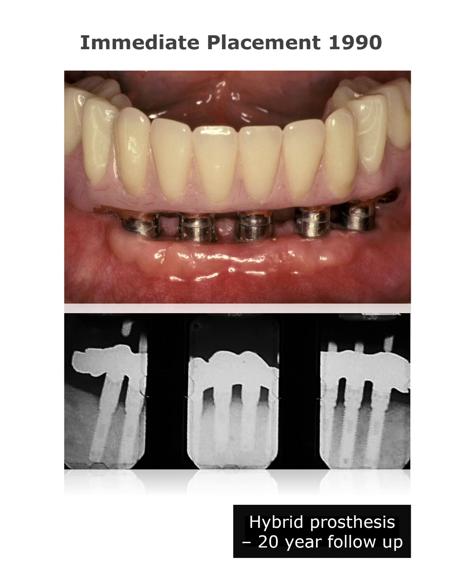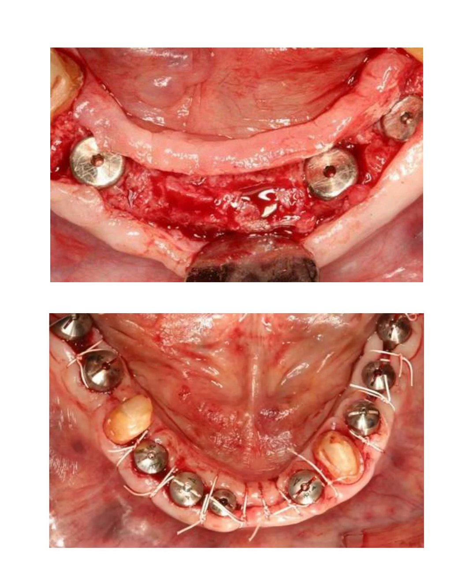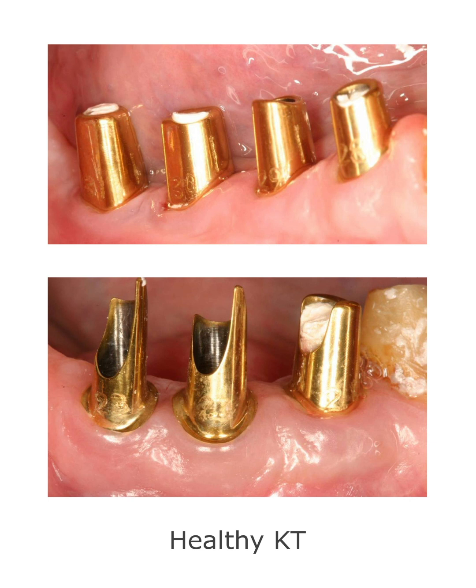So when you're doing the mandibular surgery, look at the keratinized tissue, look at both mucogingival junctions, and then make your incision appropriately. I like to usually go mid-crestal. Here's a second stage surgery on some mandibles in the anterior mandible. Implants in the anterior mandible, and you can see healthy bands of keratinized tissue on both sides. And we have sutured that in this case with Gore-Tex sutures, which don't harbor bacteria. And here is the final result with healthy keratinized tissue, both buccally and lingually.